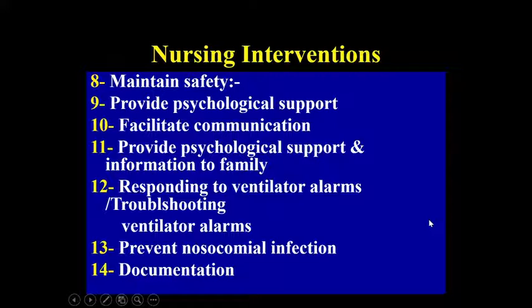Do not put it in silence. That is the most important thing. If the ventilator is talking too much, I know that nobody likes a talkative person. The ventilator becomes too talkative. Do everything, but don't mute the ventilator. That's my request to you all in folded hands. Now, the other things: prevent nosocomial infection, and document whatever you are doing.